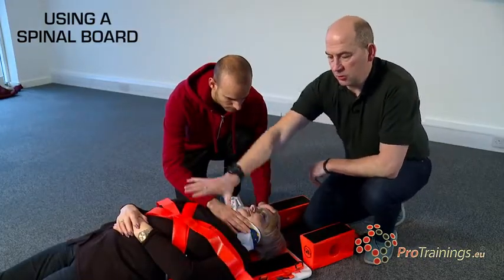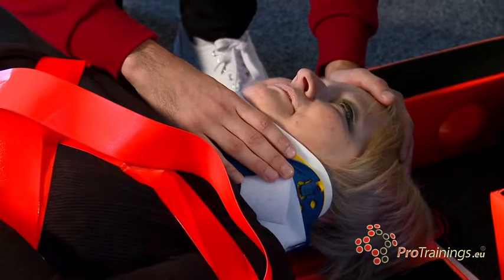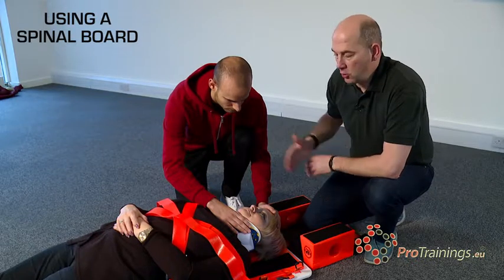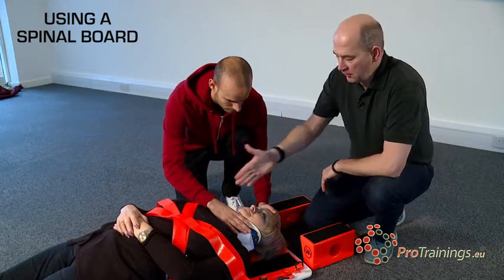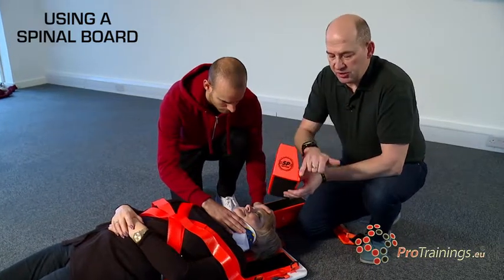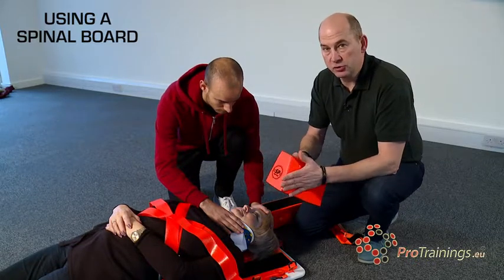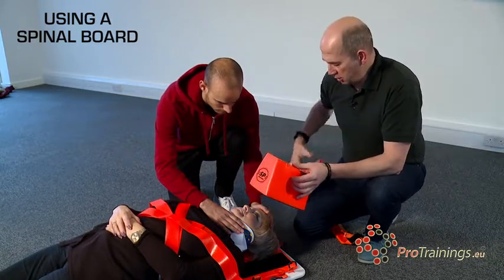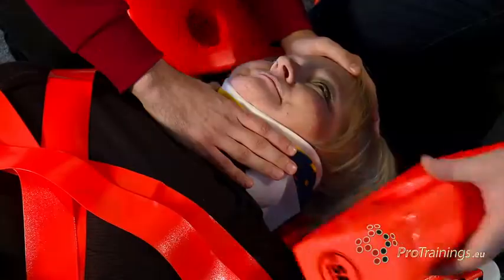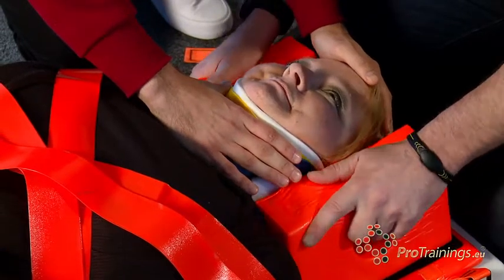Once the torso is fixed and tightly strapped down, we move to the head end — always the last part to be fixed. With hands maintaining c-spine throughout, they are moved out of the way and the head blocks are inserted. There is an angled side and a flat side: the flat side goes to the head, the angled side goes on the outside. Both blocks are applied simultaneously, snugly to the side of the head to keep it in position, and velcroed down.